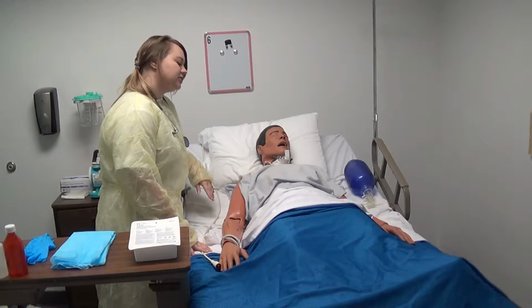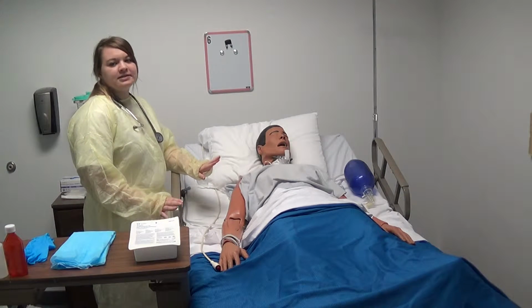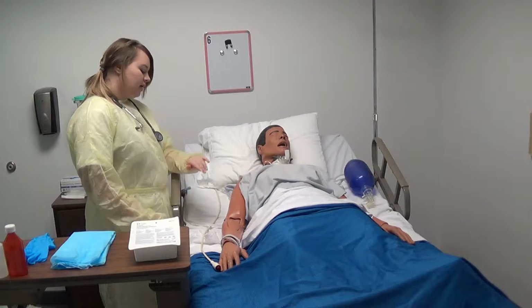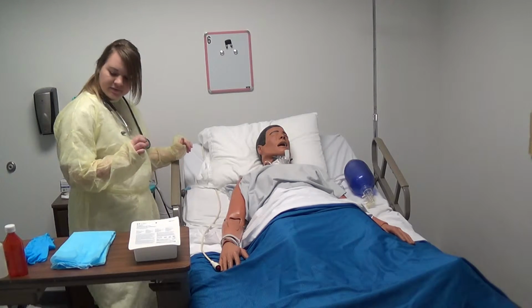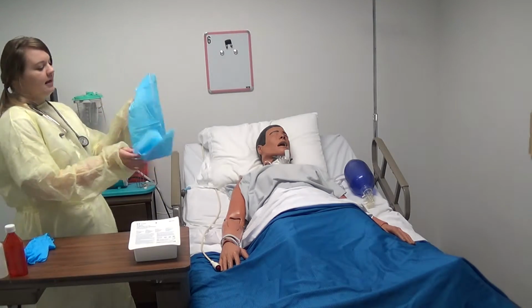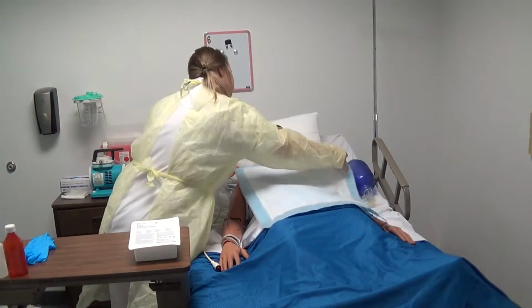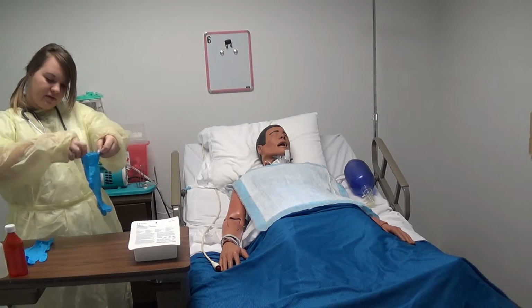I'm going to establish a distress signal and let him know that if at any time he needs me to take a break, stop, or he's having trouble breathing, to raise his left hand. I have the bed up to a working level for my height. I'm going to lay this straight down because it can get kind of messy. And I'm going to put on some non-sterile gloves.